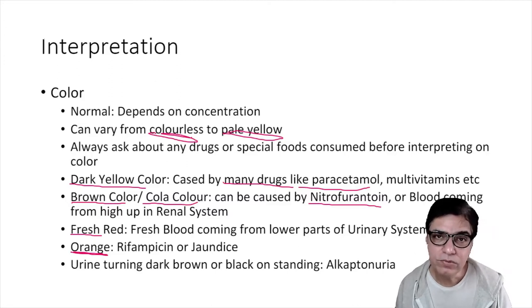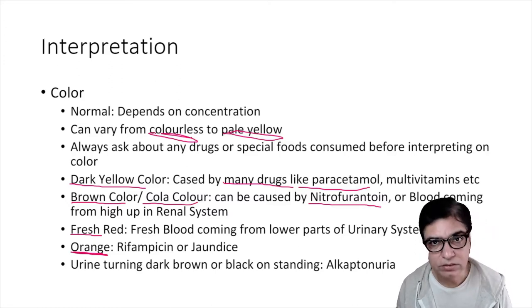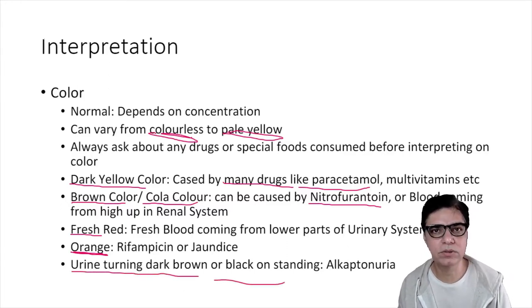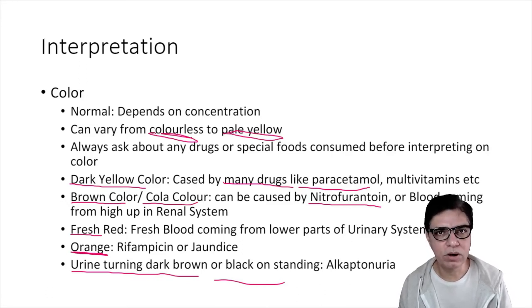And especially if you are confronted with a urine sample which turns dark, like dark brown or black on standing. So for example, sometimes you are busy, you didn't get time to dip the urine, you are doing something else, and you come back maybe after 15-20 minutes and you see, well, when the parent gave me the urine sample, it was yellow or dark yellow, and now it has changed color to dark brown or black.